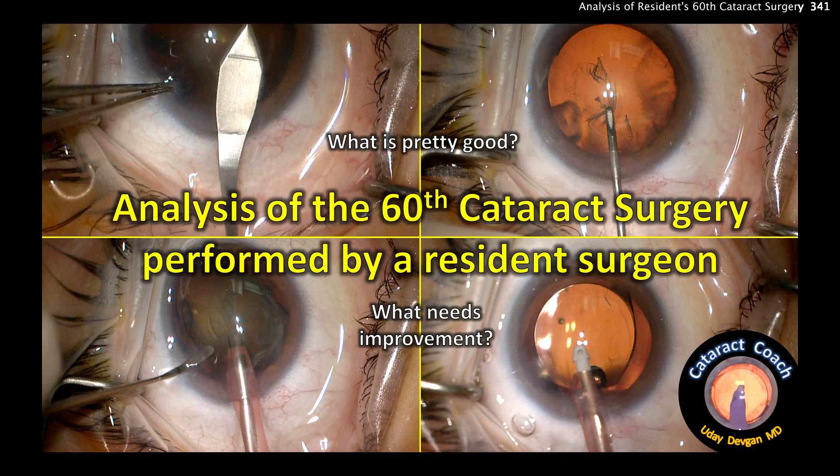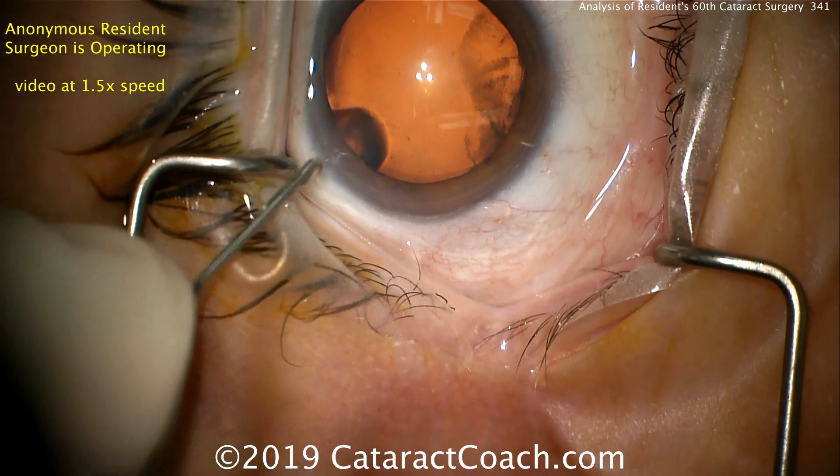CataractCoach.com. We have an analysis of a 60th cataract surgery performed by a resident surgeon in training. So what's good here and what needs improvement?